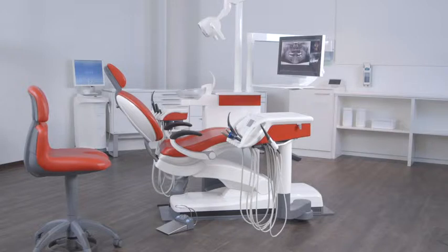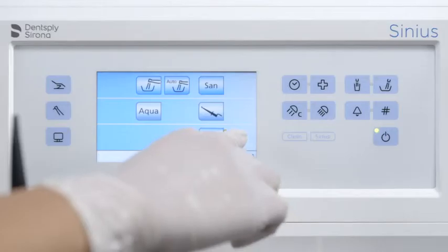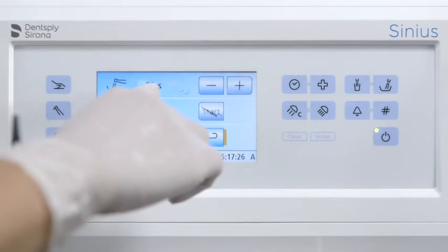In this video, we show you how infection prevention procedures are easily and safely carried out on Sinius. After every patient, press the submenu button in the start screen to open the infection prevention programs.